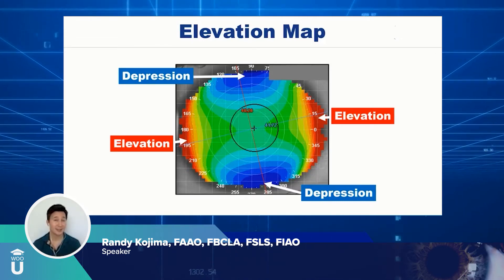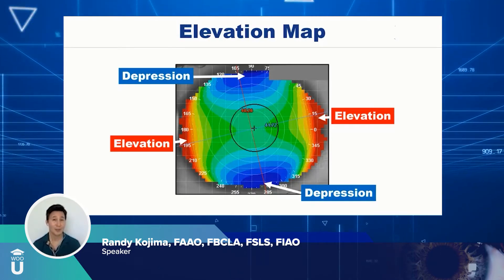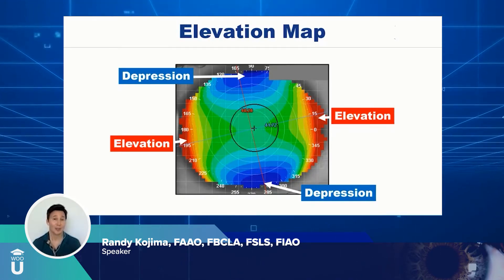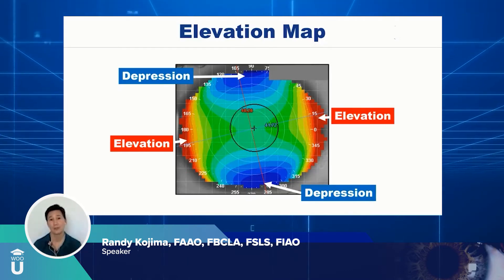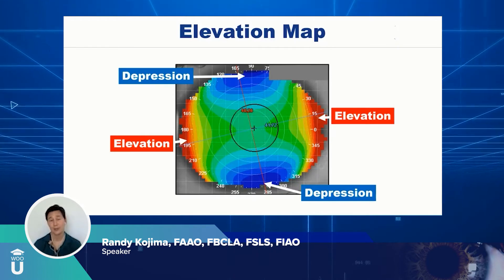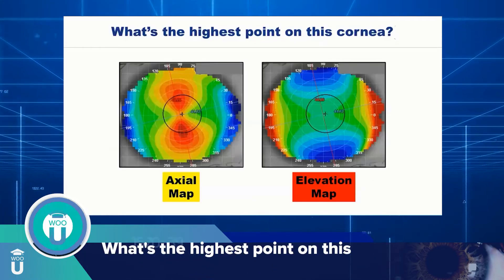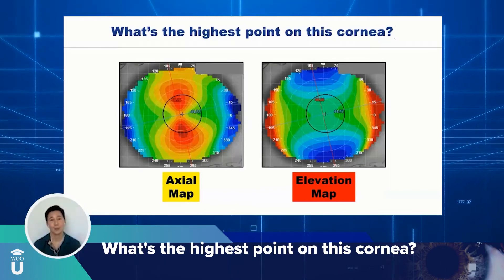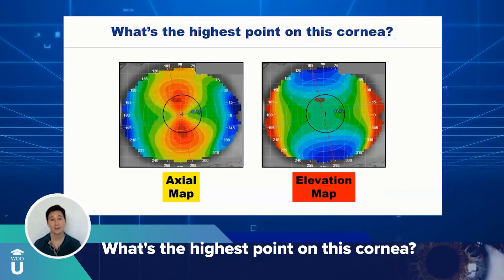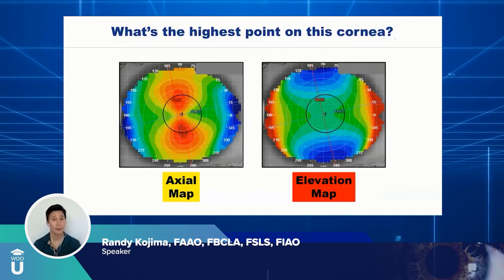In a case that's as easy as this, it's probably not necessary to use an elevation map, because you would know a contact lens is going to bear across the flattest meridian and lift across the steepest meridian. But when we start dealing with the irregular cornea, understanding the elevation map becomes really, really important. When we look at this eye, we want to shift over to the elevation map to understand where our landing and lift will be.